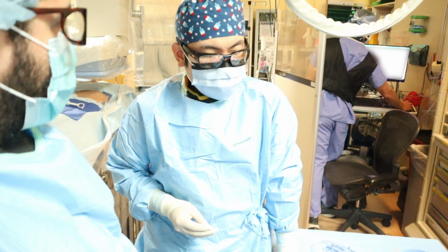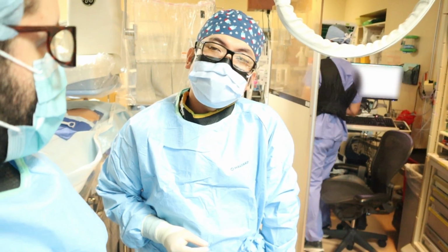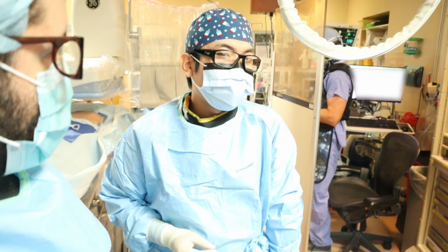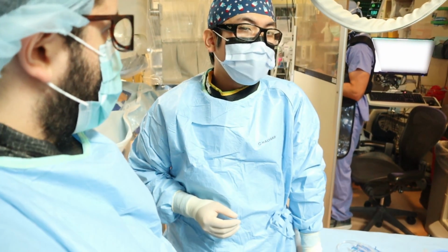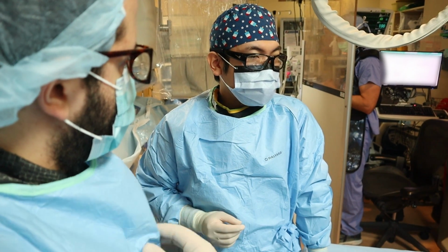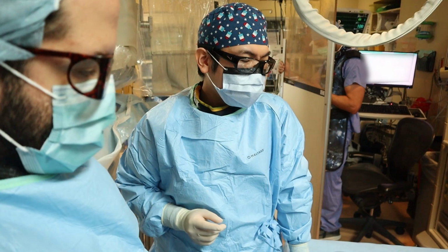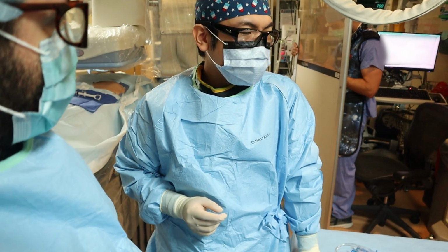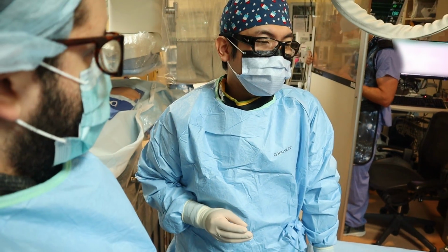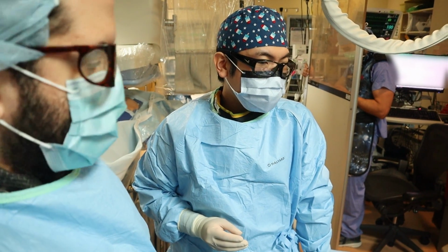Gastrostomy tube placement under fluoroscopy is a routine procedure that we do every day in IR. It's a high volume procedure pretty much everywhere where IR service is offered. But gastrostomy tube placement is a high-risk procedure that can go wrong very quickly, requiring surgical emergency backup, and it's something that we take very seriously and make sure that we do this right without any risks to the patient.